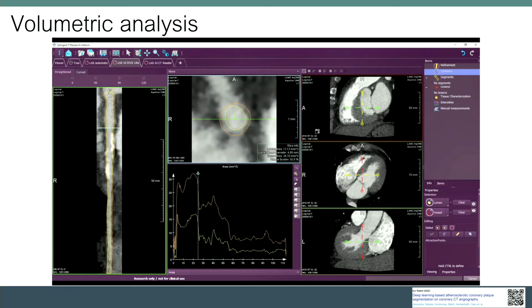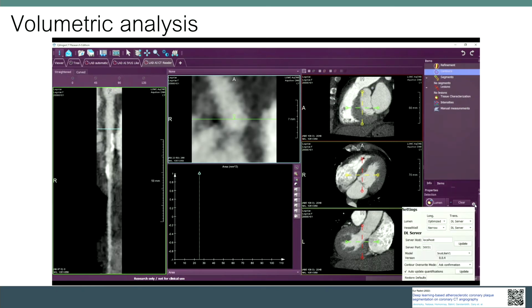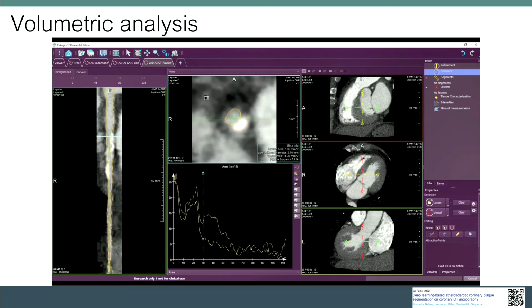which automates the plaque segmentation. And this is now also implemented in METIS. It's an open source deep learning model. As you can see here, you can select it. And basically in a couple of seconds, you arrive with a plaque segmentation which was trained on over 3,000 plaques of several hundred individuals. And basically you get the results.